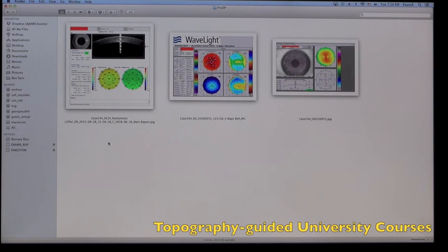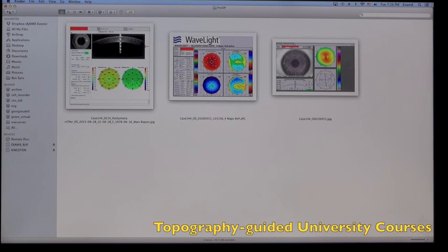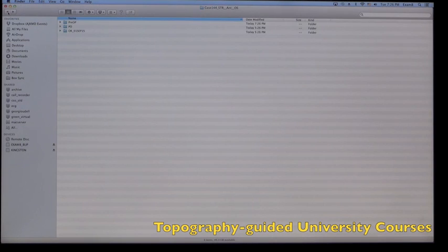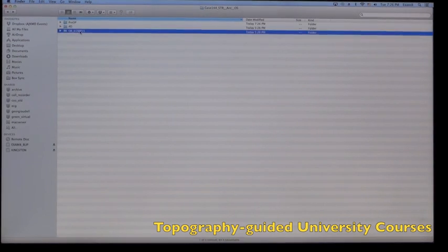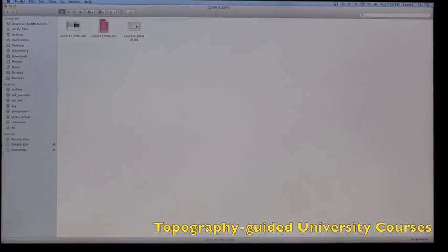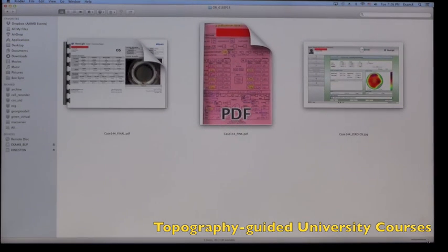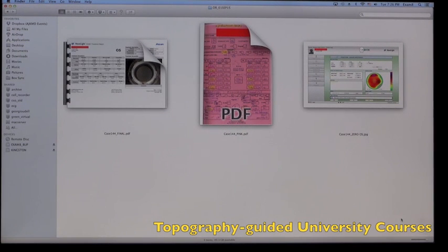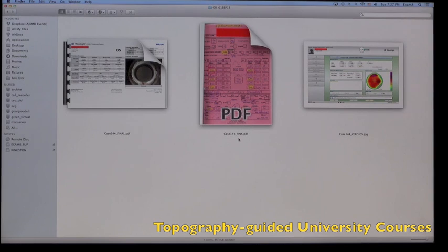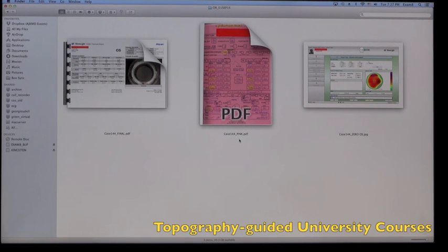So these are the pre-op data for us to evaluate. So let's click back and go and see on the OR day. So on the OR day, what we have for you is our pink sheet, which is basically the treatment planning platform in which we have all the data collected for the patient.